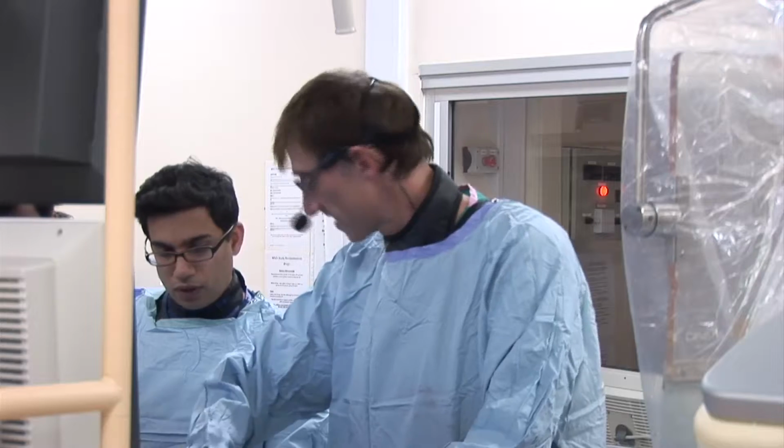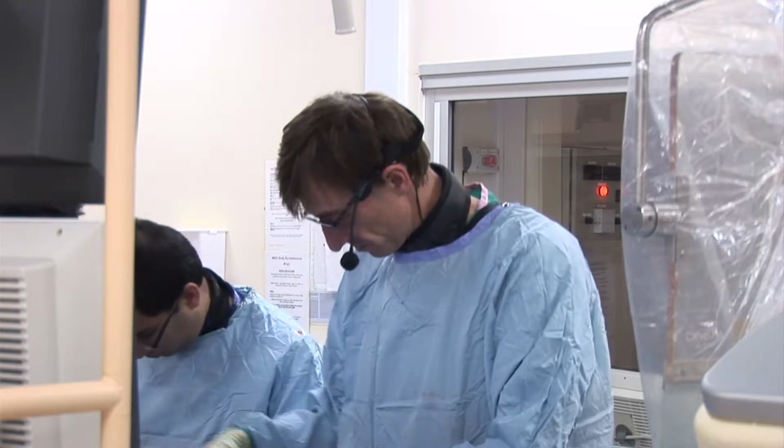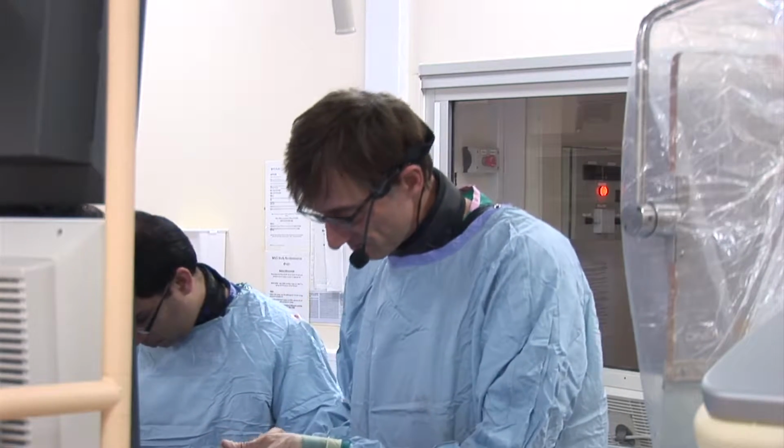Now, there are two ways to cross this blockage. One is to push the wire through the material in the middle of the vessel, and the other is to cross into the wall of the vessel and create a track in this tissue plane before re-entering the vessel lumen on the other side of the blockage. This is called a so-called dissection and re-entry technique. In addition, either of those two techniques can be used moving forwards through the blockage, called anterograde, or moving backwards from the feeder collateral vessels, called retrograde.